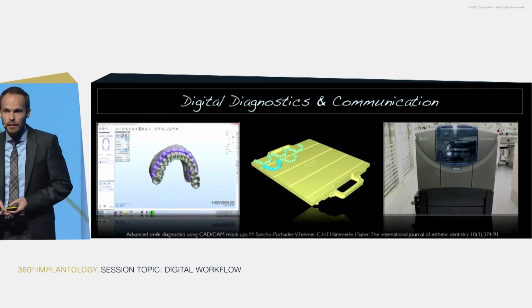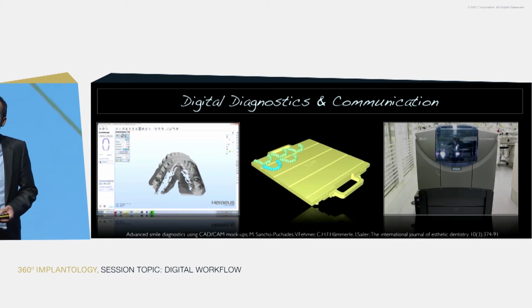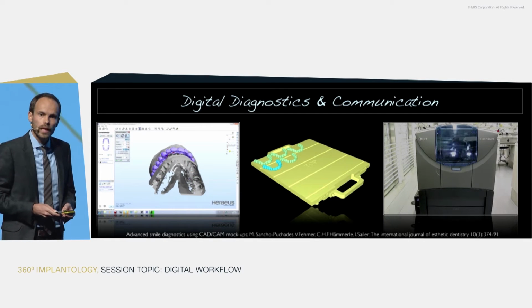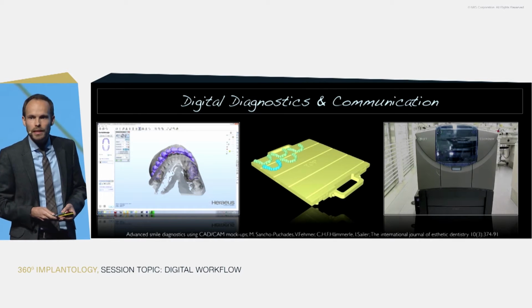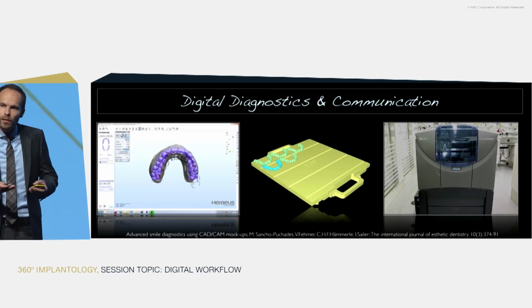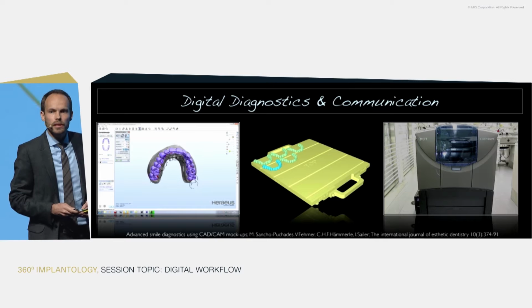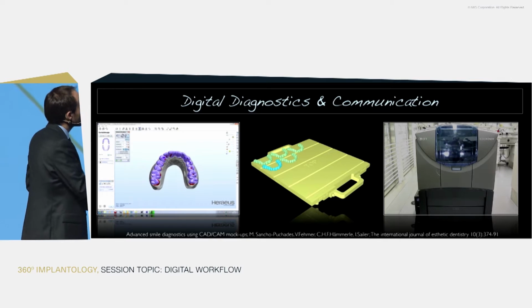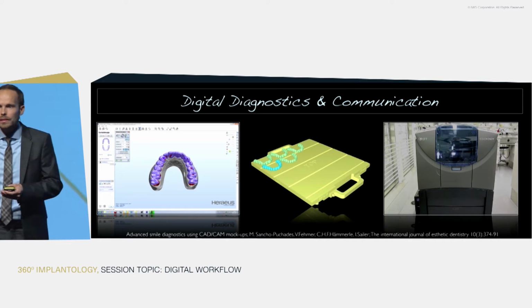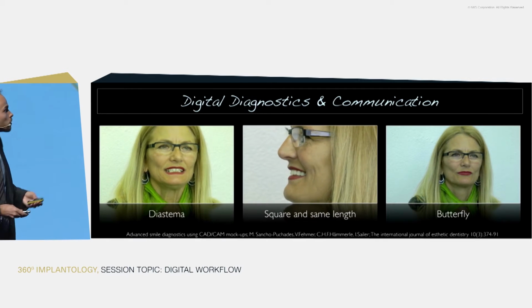So what we tried, and how we tried to utilize this new technology with her, is we created a complete set of teeth, a digital setup for her, if you want to call it that. I don't want to tell you anything, this takes a lot of time. To create these 27 teeth in her case, maybe you spend 4 to 5, sometimes 6 hours really aligning the teeth properly, creating them, checking the morphology, checking the bite, all of these aspects. But once you reach the first set, it's very easy to save and store this and come up with a second version, a third version, a fourth version even.